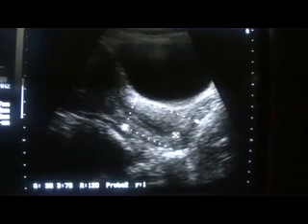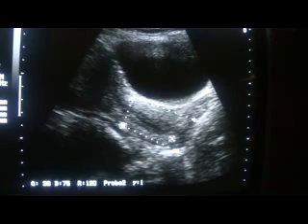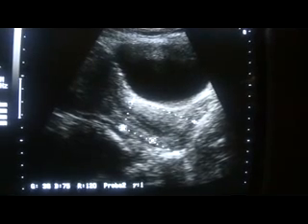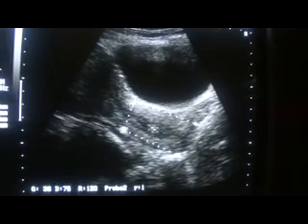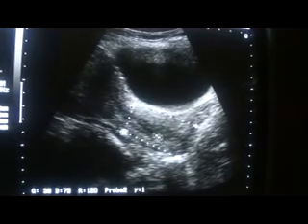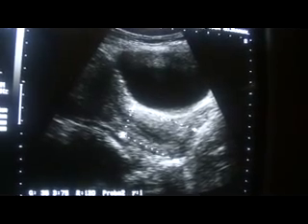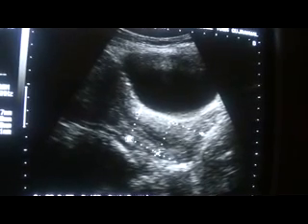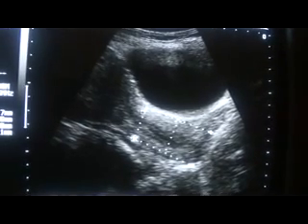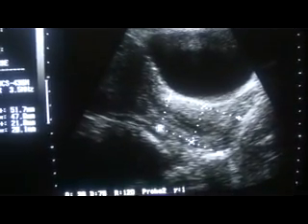This is the anterior wall, this is the posterior wall. This is the endometrial canal, and these are the focal lesions. This gives a bullseye appearance, or in other words, it is echogenic in the center and surrounded by a hypoechoic periphery. This is the echogenic center, and this is the hypoechoic periphery.